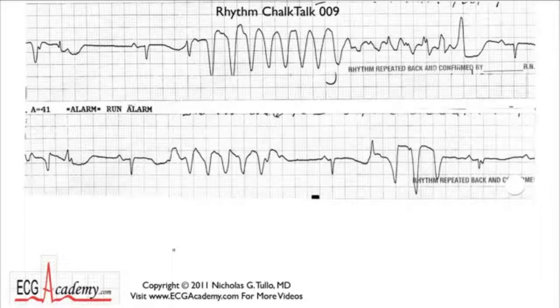Chalk Talk number 9. Chalk Talks assume you know the basics, so what I'm trying to do is get you used to reading more complicated tracings. And this time I'm going to do it a little bit differently. We're going to talk clinically, okay? Because a lot of you will have to take board questions, and I want you to get thinking along those lines. So let's imagine a case, okay?